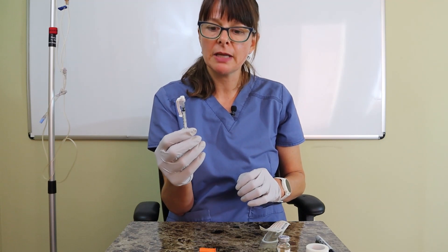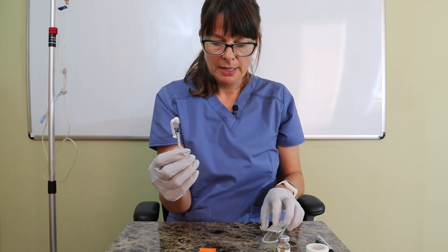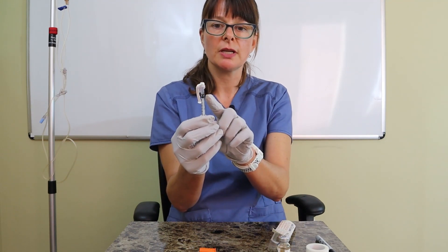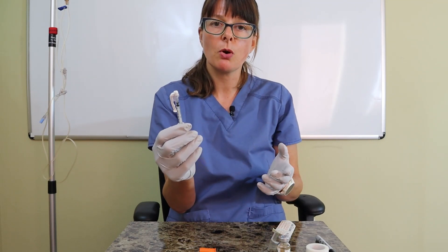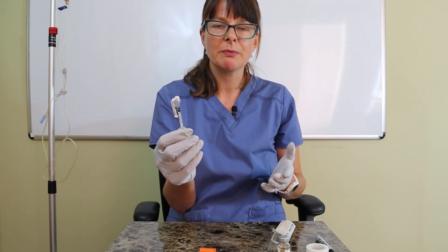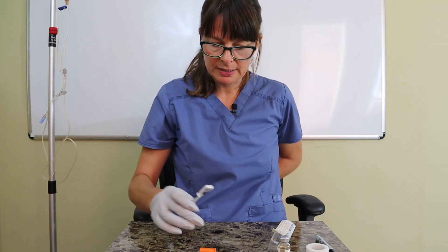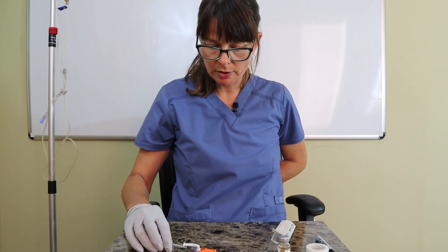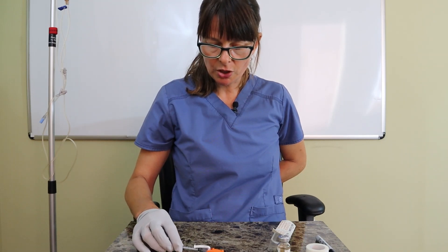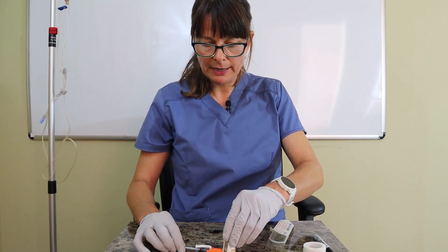As with any medication, we need to be very careful when we recap the needle. We cannot change the needle between drawing up and administering, so recapping requires extra care — if we poke ourselves we might inadvertently administer insulin and become hypoglycemic. Use the one-handed recapping technique: put your non-dominant hand behind your back, slide the cap on carefully, and use another object to secure the cap in place.